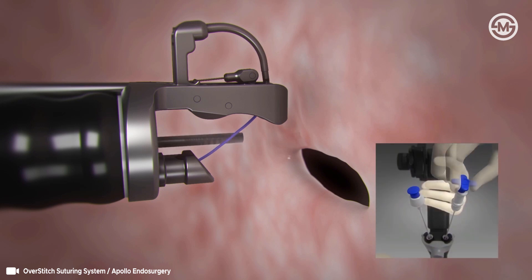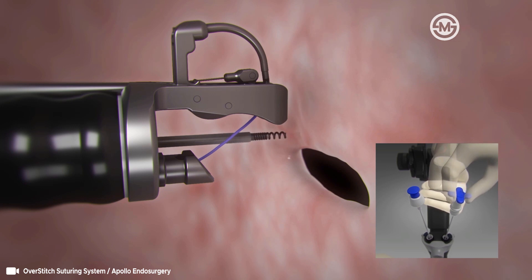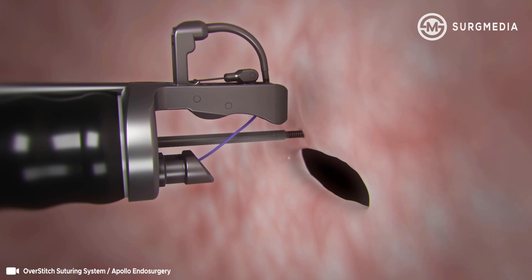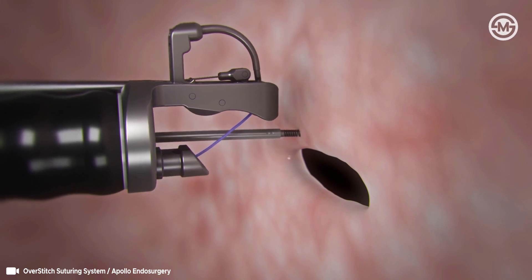Advance the tissue helix through the 2.8 millimeter scope channel. Push down on the blue knob to expose the helix. Advance the helix to target the appropriate tissue. Using forward pressure, turn the tissue helix knob in the clockwise direction to capture tissue. To ensure a full thickness bite, maneuver the scope left so that the helix is right of the needle guard.